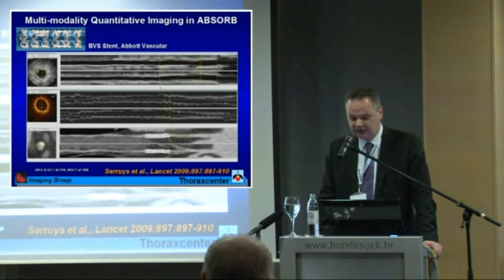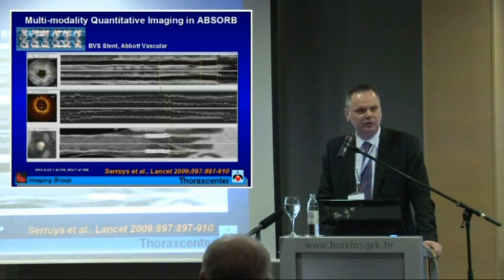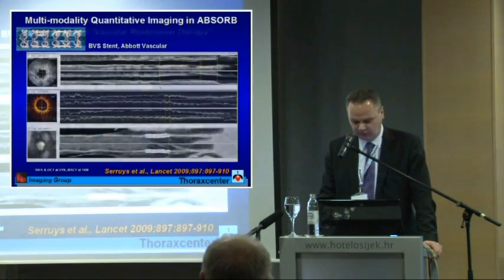By the way, you can see here on the bottom that with MSCT, which also involves radiation, the plastic stent, which is the PLLA stent implanted here, is invisible. But a metallic stent, which had to be implanted as a bailout at the distal part of the Absorb stent, is very much visible. It actually causes an artifact on MSCT.